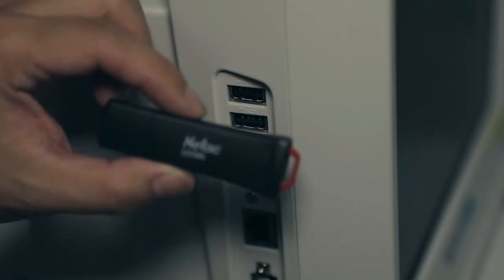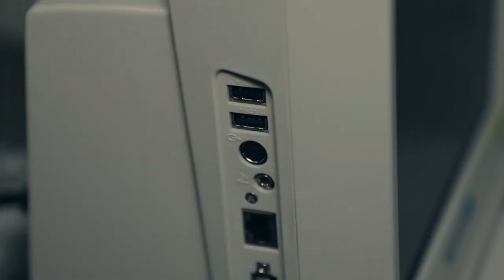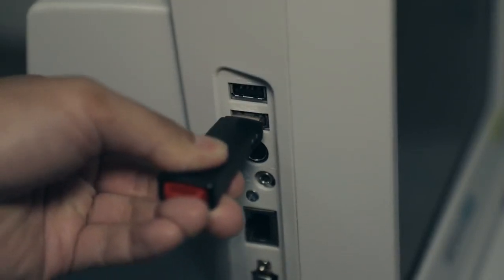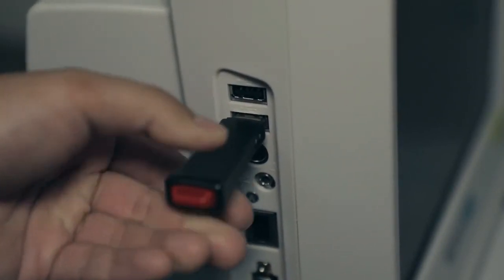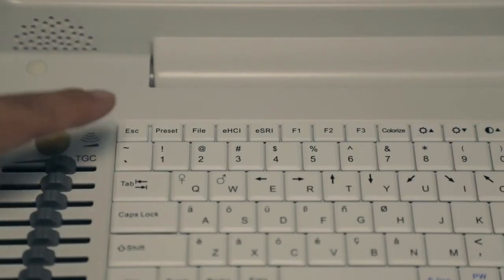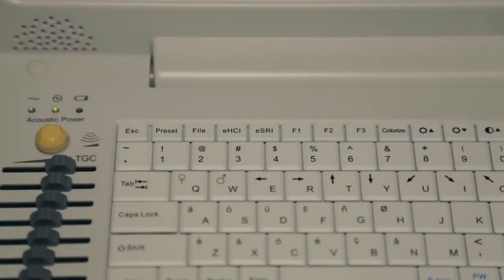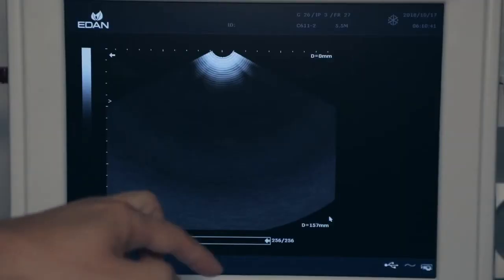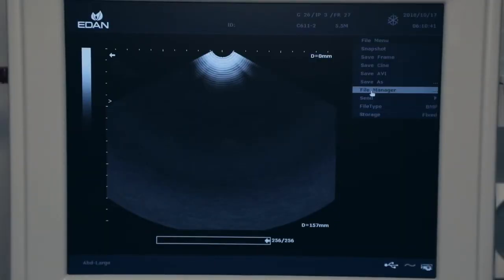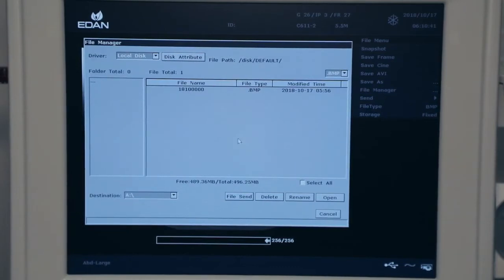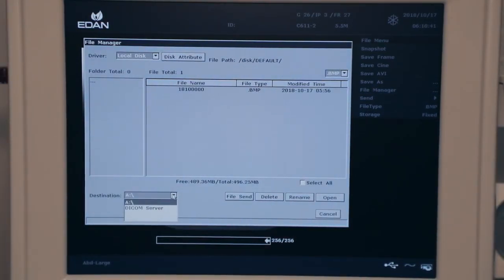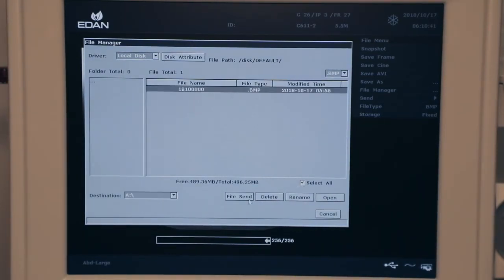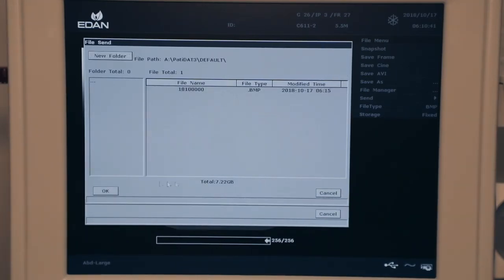To transfer images, connect USB to USB port on the side of the unit. Press file key, highlight file manager using trackball and press set. On file manager display, select a drive under destination, highlight all images to be transferred, and press file send.